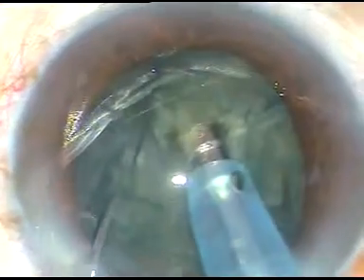Hold the nucleus firmly and chop the nucleus. Rotate the nucleus, chop it at another place. This free nuclear fragment can be taken out. Hold it here — this free fragment is also removed.